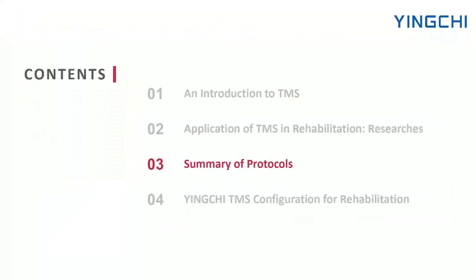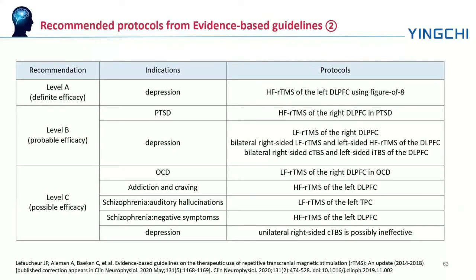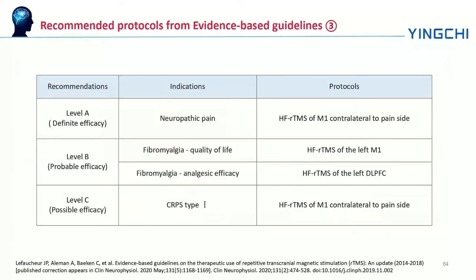And here are some protocols summarized from the evidence-based guidelines. As you can see, we have many protocols for neuropathic pain, motor stroke, depression, and for other kinds of pain syndromes.